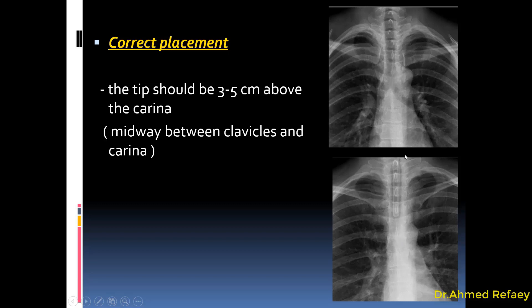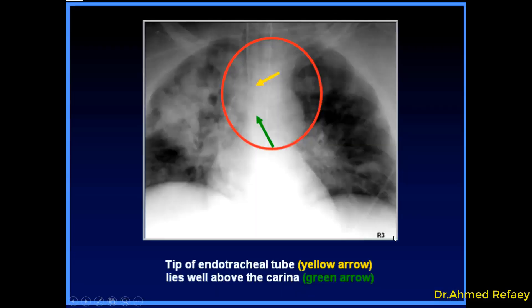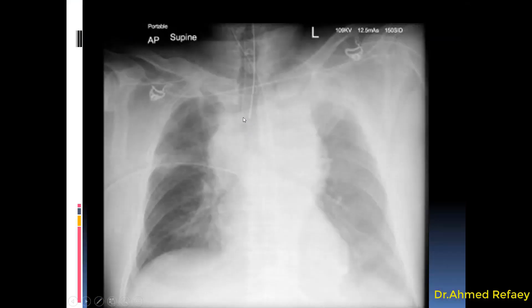As you see here, this is the tracheal airway, this is the right main bronchus, this is the left main bronchus, and this is the region of the carina. The tip of the endotracheal tube has to be three to five centimeters above the carina, or midway between the medial end of the clavicles and the carina. Here are additional examples showing normal placement of the endotracheal tube, with the tip three to five centimeters above the carina.